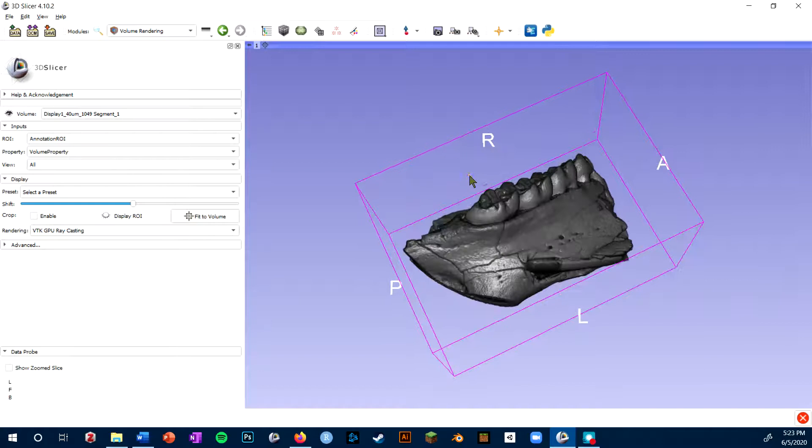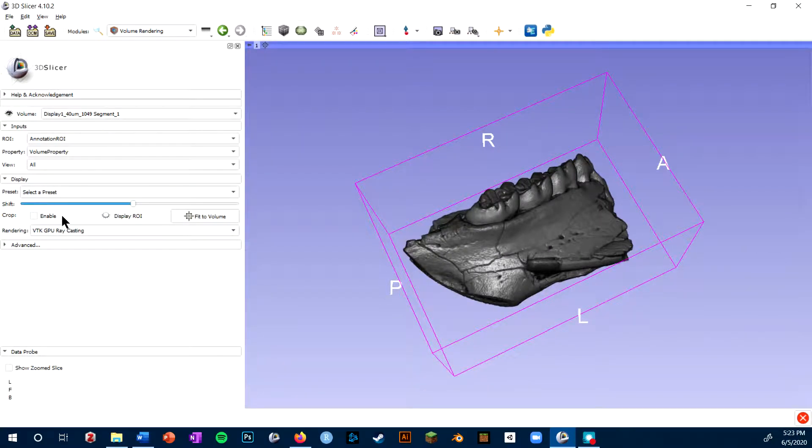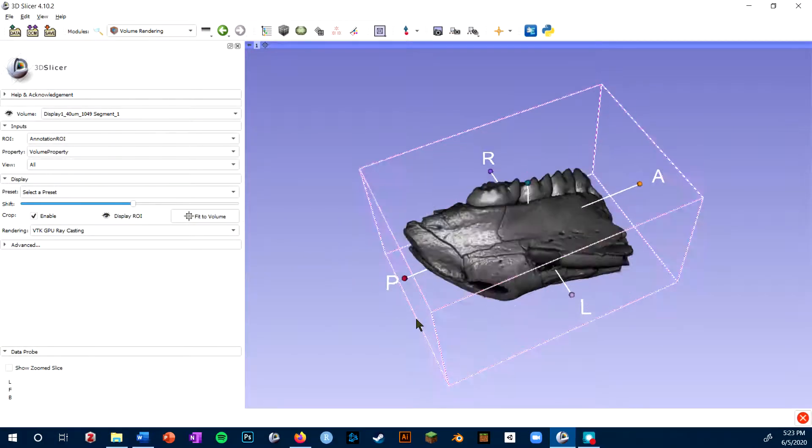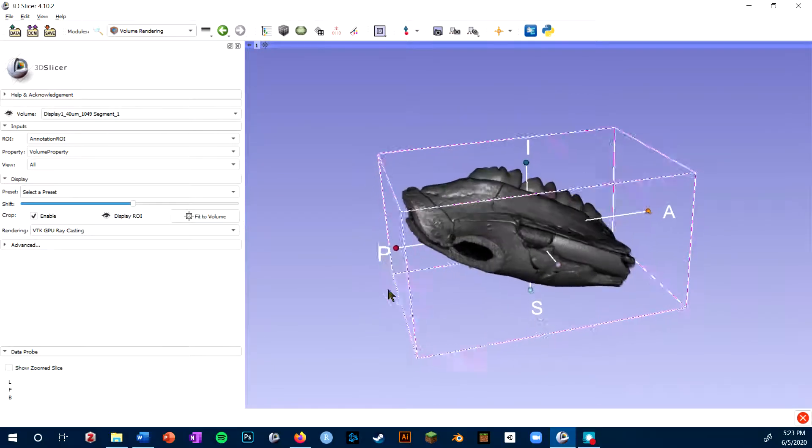Some other useful tools in the volume rendering module are this crop function. If I check enable and then display ROI, which stands for region of interest, I get this box around my specimen.